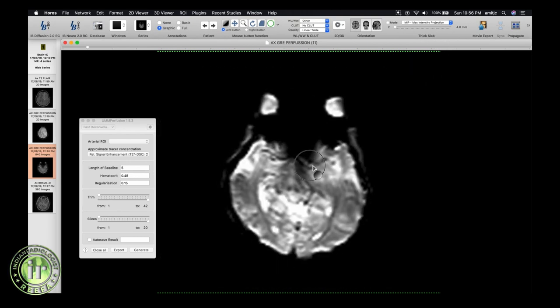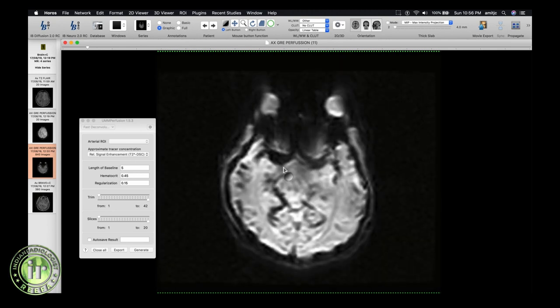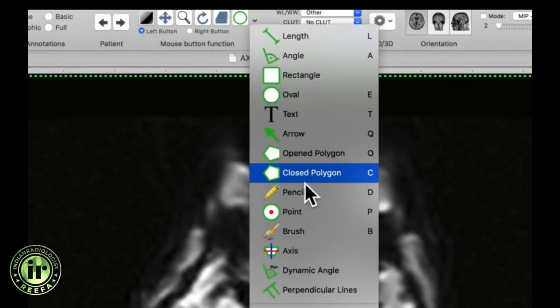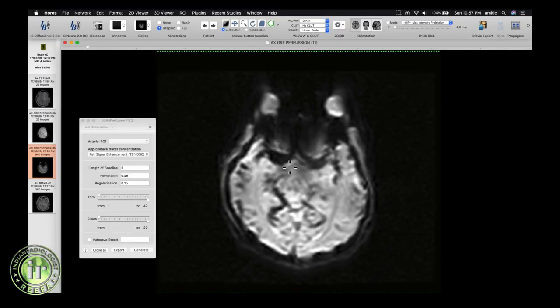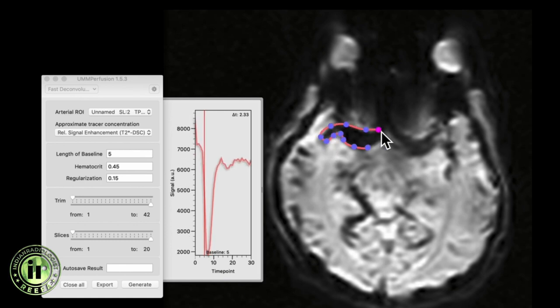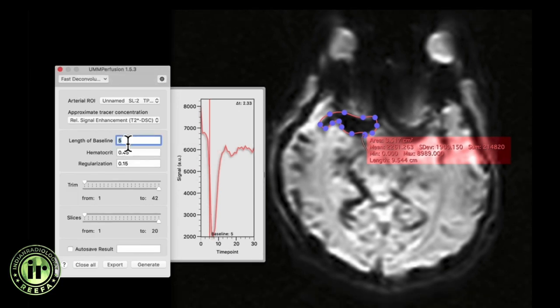Go to the level of the skull base and go to the time section where maximum susceptibility is seen arising from the middle cerebral artery. Draw a closed polygon ROI which will serve as the ROI for defining the arterial input function. I am selecting the baseline as 2 because the contrast injection was done too early in the perfusion sequence.